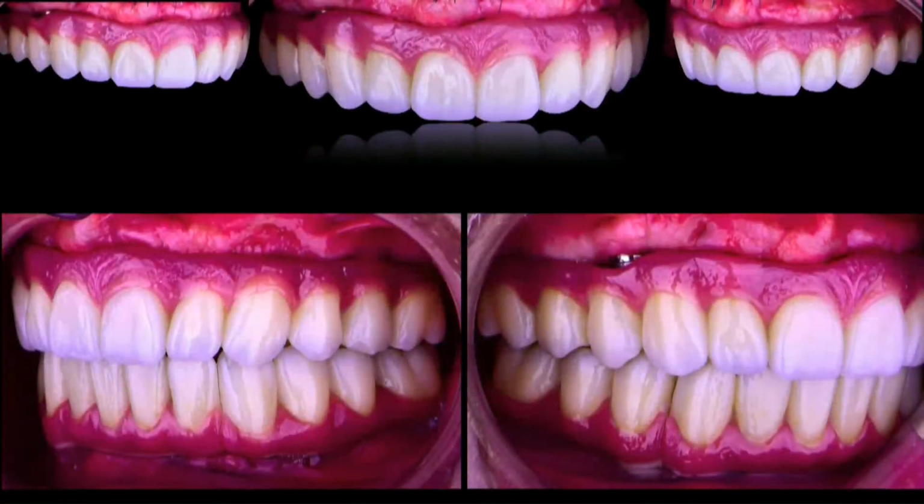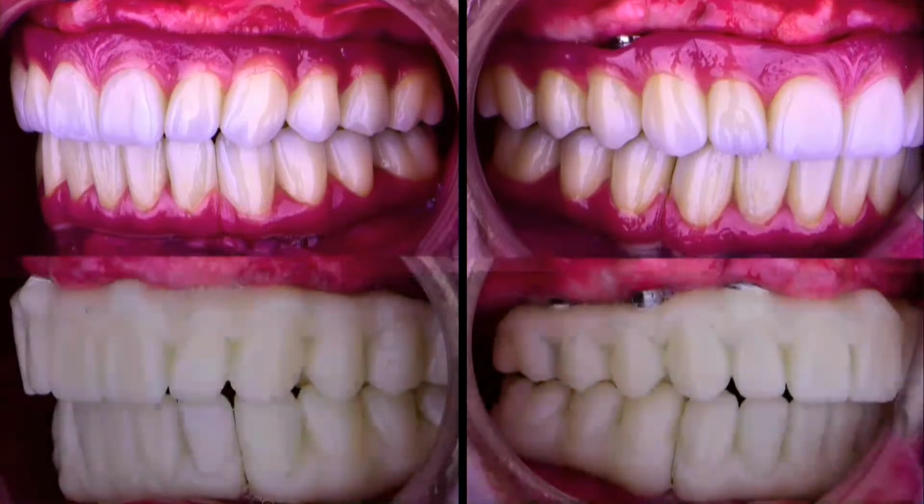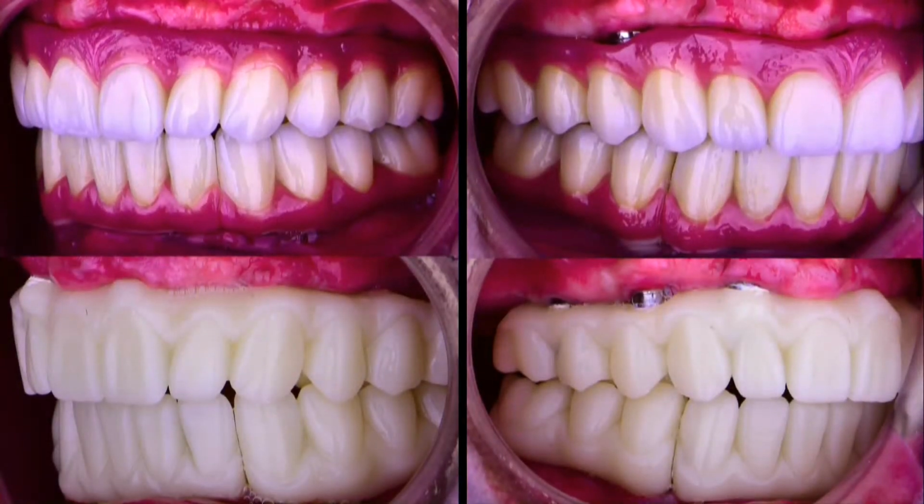And this is how the patient looks after. And when we compare our after to the prototype, we see that we don't have much of a difference, especially when we replicate things very accurately. You do see spaces in the laterals and centrals, and we purposefully did that because we wanted to keep space for layering the lithium disilicate later.